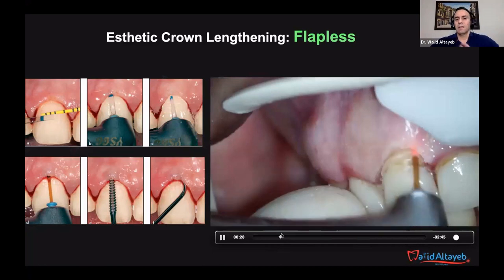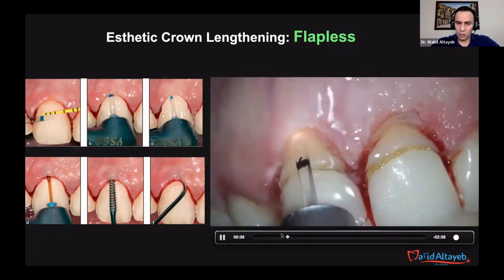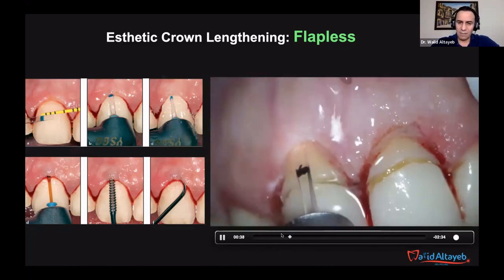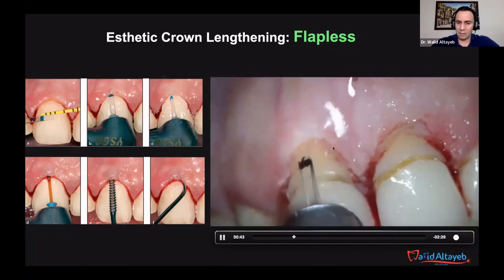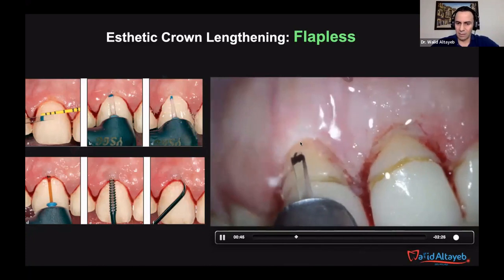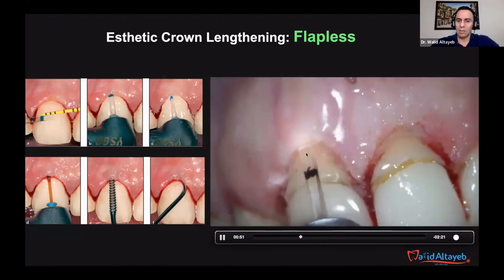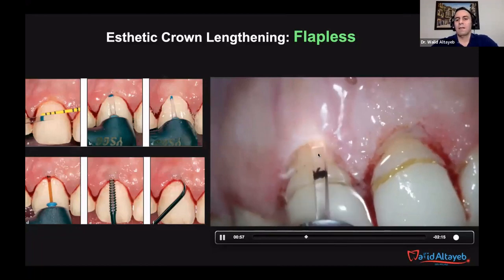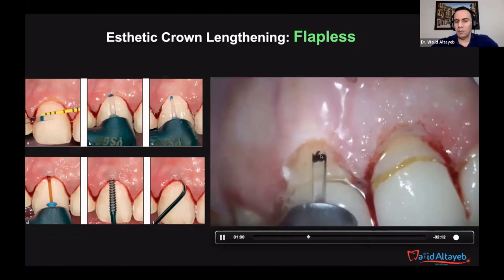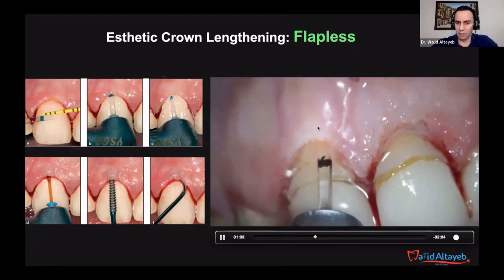First, we bring the MC3 tip. This chisel tip is very nice because the thickness of this tip is 0.3 mm. So it's very easy to insert it in the space between the gum and the tooth, and you create this pouch. We mark this tip for 3 mm. Here I mark it 3 and 4. This marker will be the new reference for you to know that you create space with a height of 3 mm.